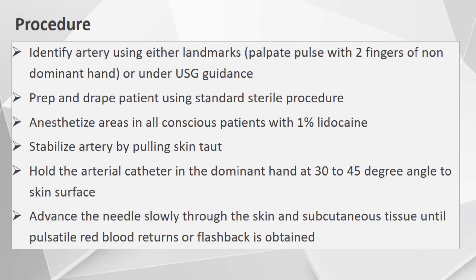After positioning, we identify the artery using either landmark technique — palpating the pulse with two fingers — or under ultrasound guidance. We prep and drape the patient using a standard sterile procedure. We give local anesthesia with 1% lidocaine in all conscious patients. We stabilize the artery by pulling the skin taut and hold the arterial catheter in the dominant hand at a 30 to 45 degree angle to the skin surface, advancing the needle slowly through the skin and subcutaneous tissue until pulsatile red blood returns as a flashback.